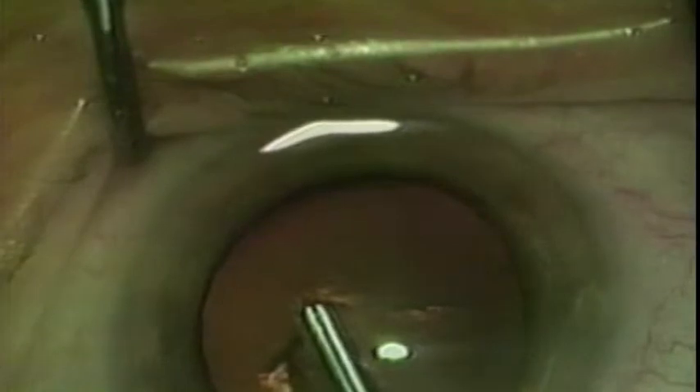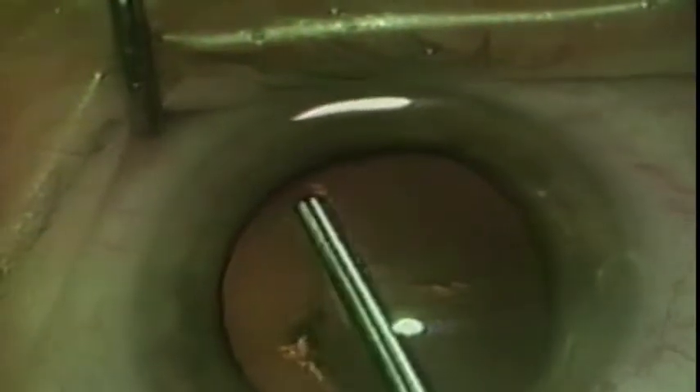The use of the new one-step forceps for capsular rexis is demonstrated. Here is a view using the Miyake technique from inside the eye demonstrating capsular rexis using the forceps.